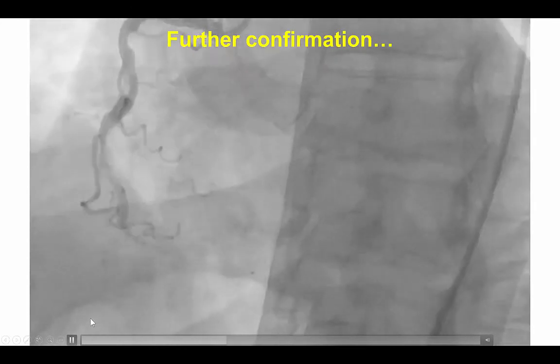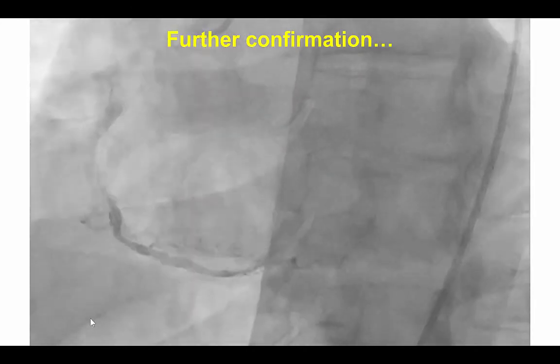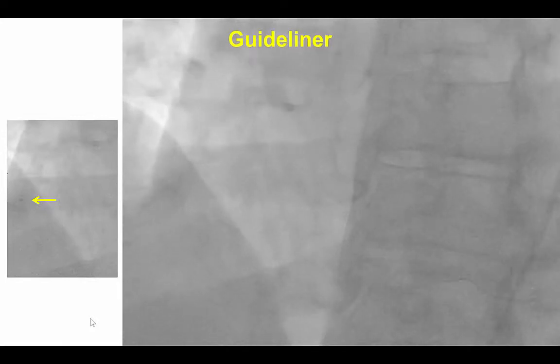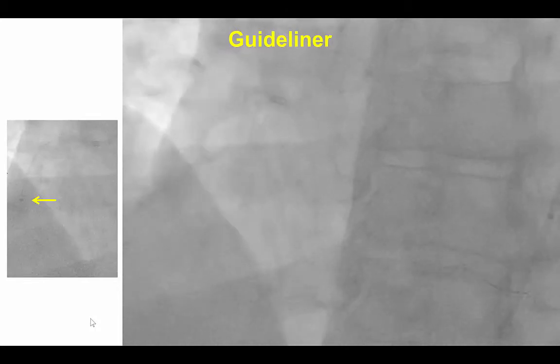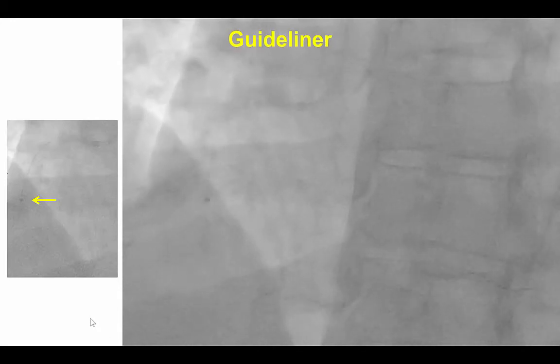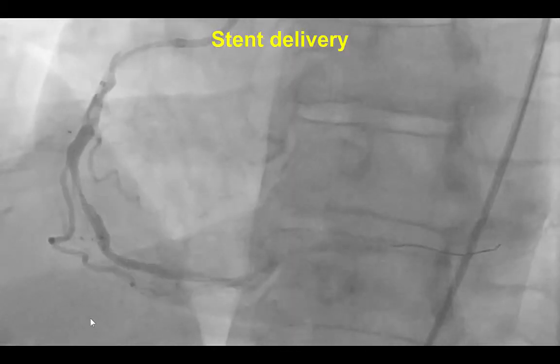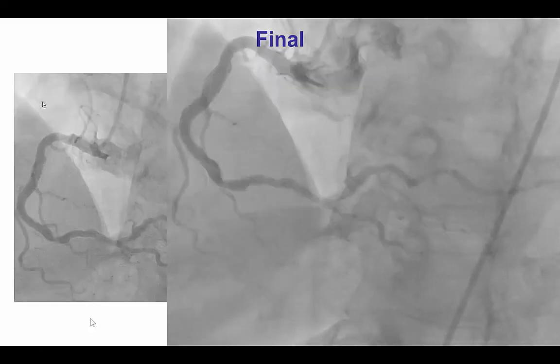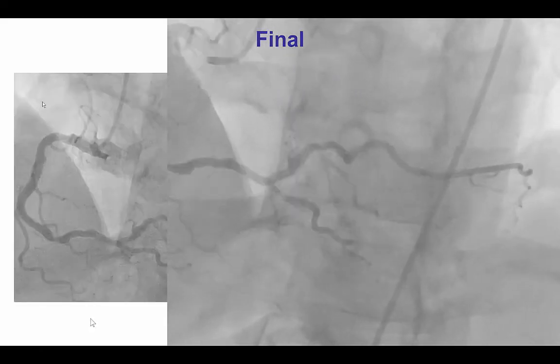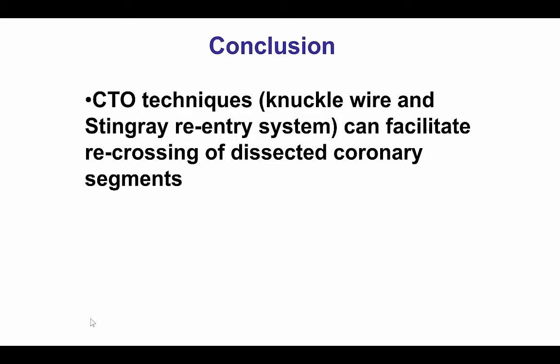That was confirmed in a different projection just to ensure that we were in the right place. After doing that we were able to exchange for a workhorse guide wire. To avoid difficulties once again with equipment delivery, we used a guide catheter extension that was advanced easily all the way to the mid-right coronary artery. We were then able to deliver several stents that provided a nice final result, restoring TIMI 3 flow in the right coronary artery.